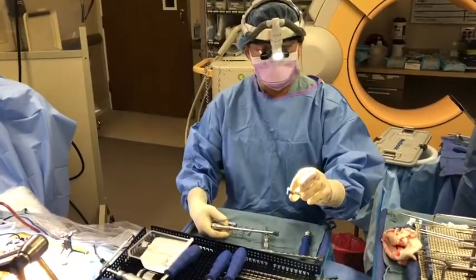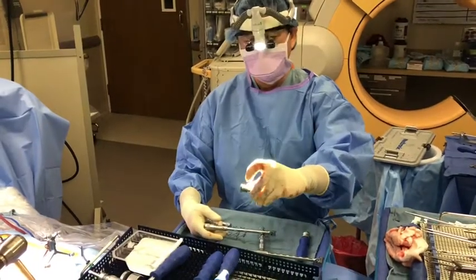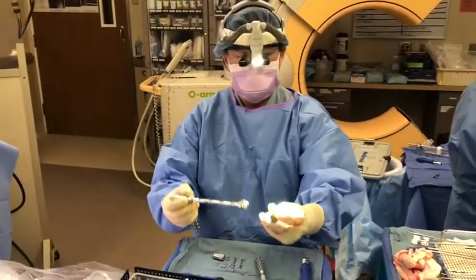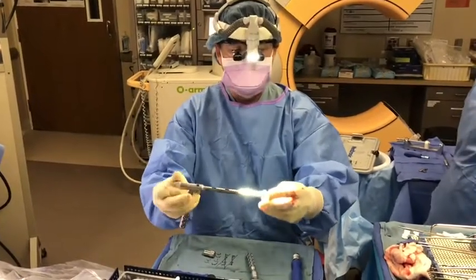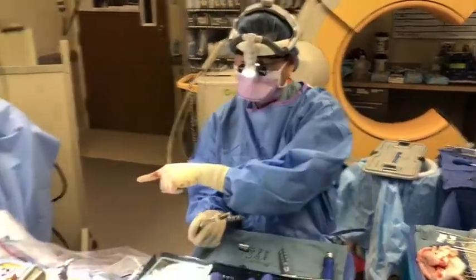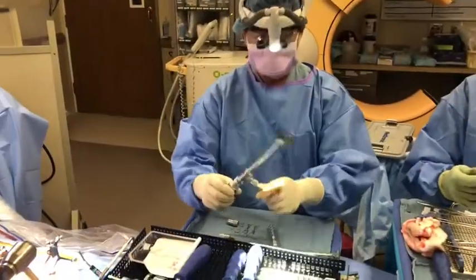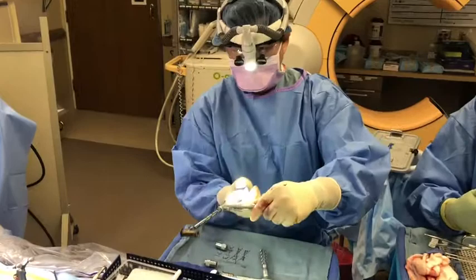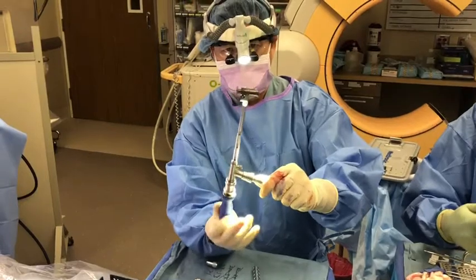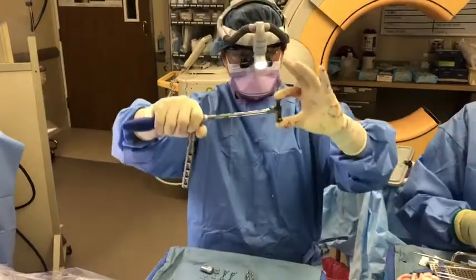I'm about to put in the implant. I'm going to drop this in end on, turn it into the right position, roll it so that I can attach the expander. Got to be a little bit like bobbing for apples. I can't put it straight in because with the minimally invasive approach, I only have a hole that big. This implant will go in end on, I'll rotate it and then expand it with this dial. You can see it's like a car jack — it gets bigger and bigger and it will jack up that collapsed space and act like a strut.